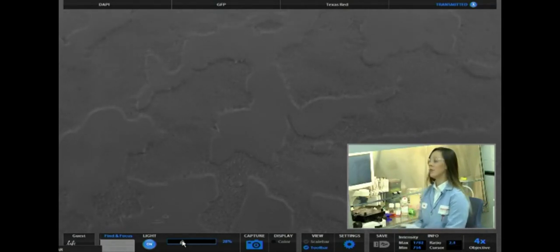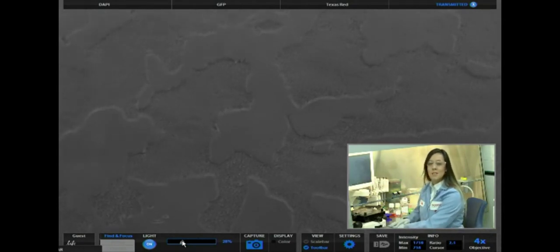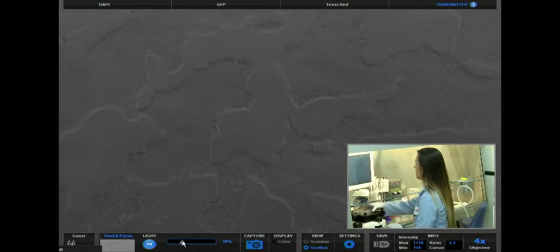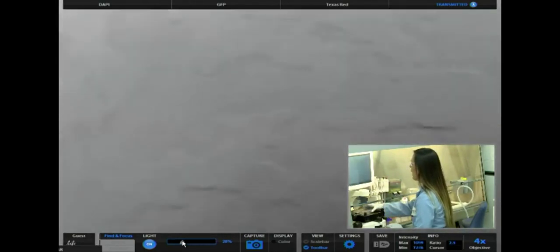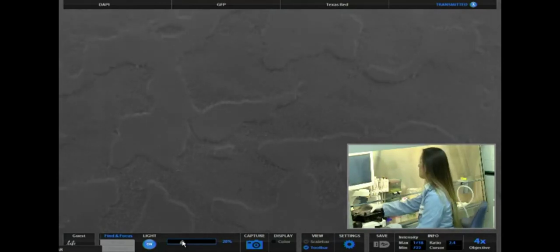That's key because if you have a not so clean culture, sometimes the neural induction won't be as specific and you'll get some contaminating non-neuronal cell types at the end. So you just want to make sure to have that clear culture throughout and there's no differentiating stem cells in there.